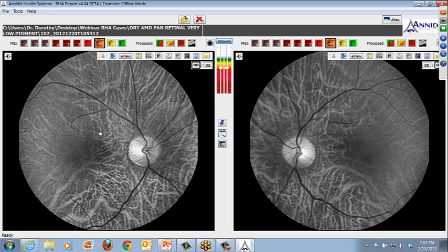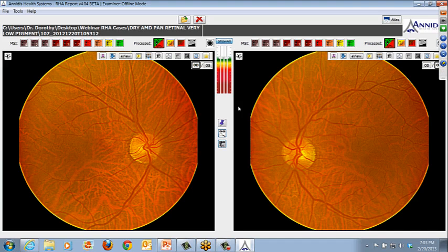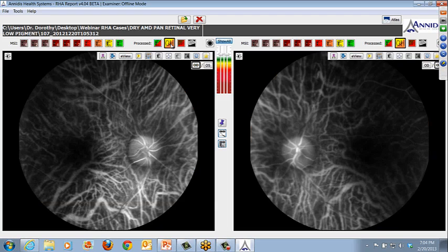And so this patient has low pigment reserves, lots of hard drusen. Yes, they're not in the macula, but in fact, this is still macular degeneration by definition. Perhaps this patient is a little bit lower risk because the location is not parafoveal.